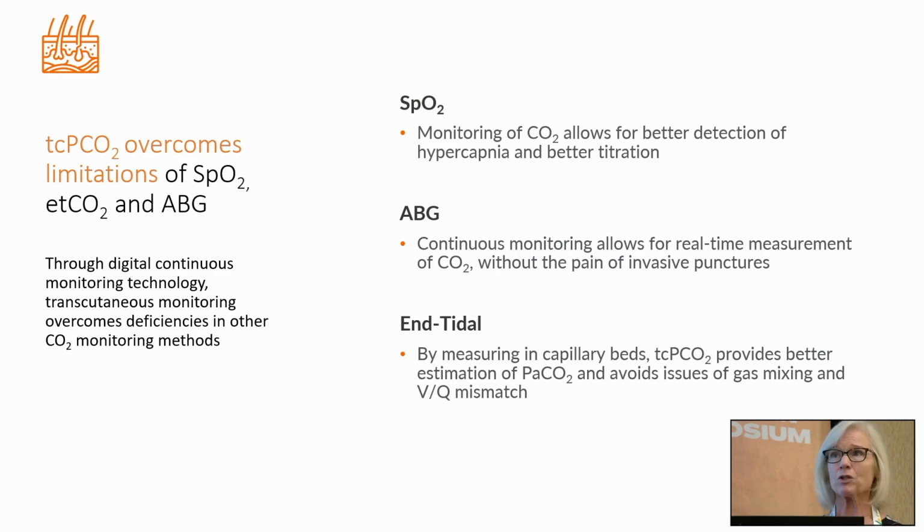So it's going to allow you to have visibility to your ventilation status, whereas SpO2 monitoring alone does not. It gives you that continuous real-time measurement. You've got your headlights on compared to the ABG, which you're just turning your headlights on every once in a while. And it overcomes the limitations of end-tidal monitoring because we don't have to worry about that ventilation perfusion mismatch, and we also don't have to worry about what's going on at the airway.